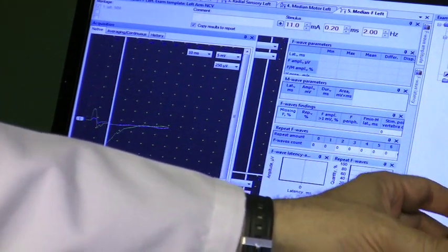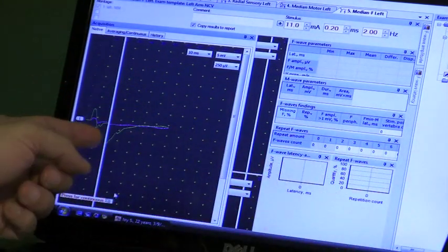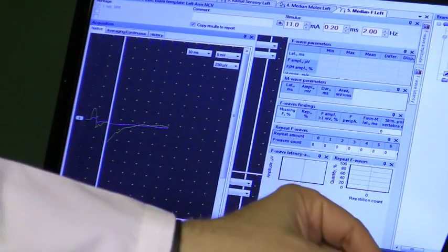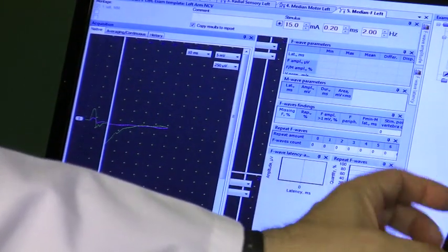So I'm going to go up. Now I'm beginning to see maybe a little bit of wave coming from the neck. You can see it here. You're going to see it better in a minute. Here we go.